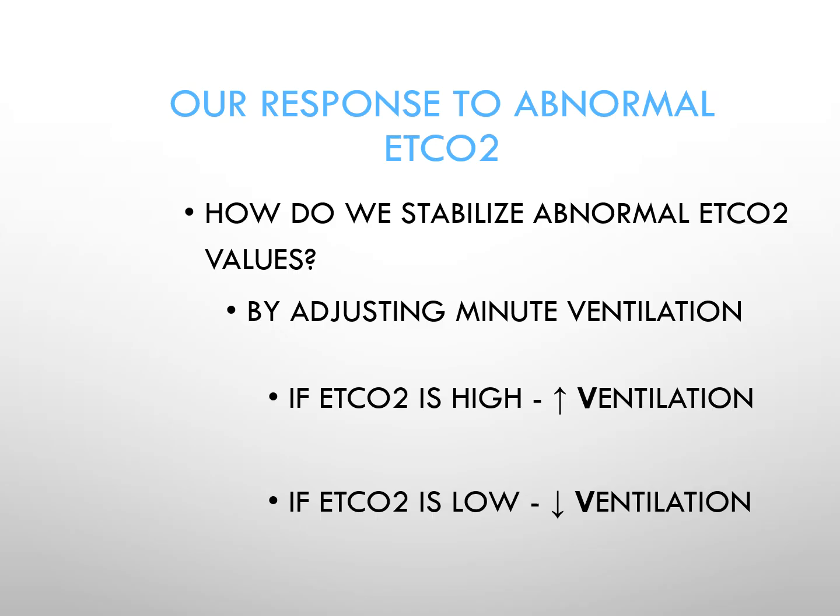Now, if the patient's on mechanical ventilation and they are over breathing the ventilator, you're probably not going to work the respiratory rate, because they're just going to breathe over that. So you're probably going to work the tidal volume. You're going to aim to actually reduce the tidal volume in an effort to try to normalize that ABG and the end-tidal CO2.